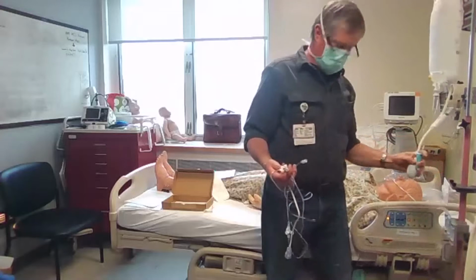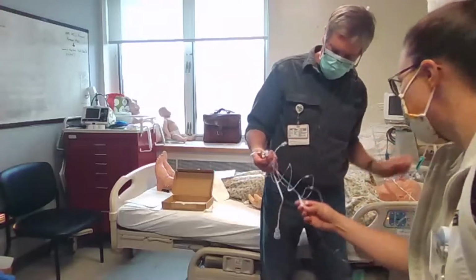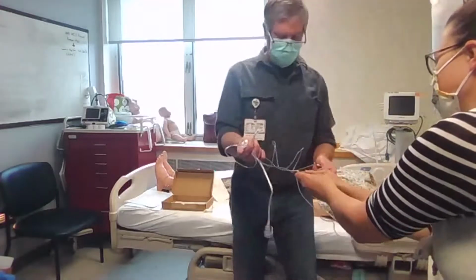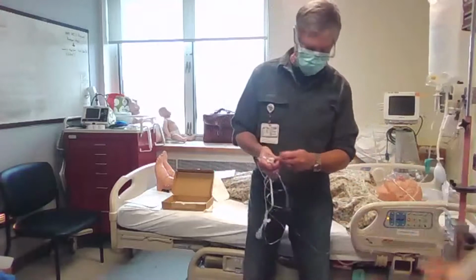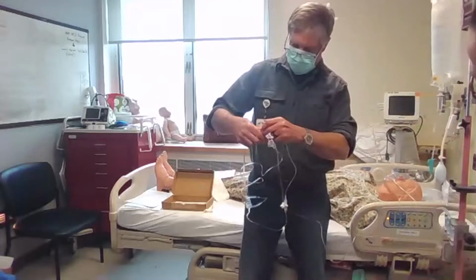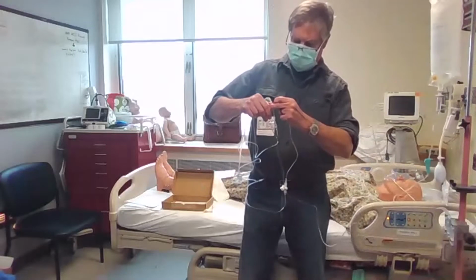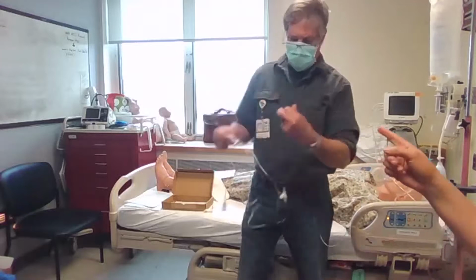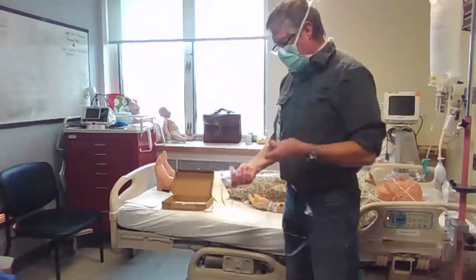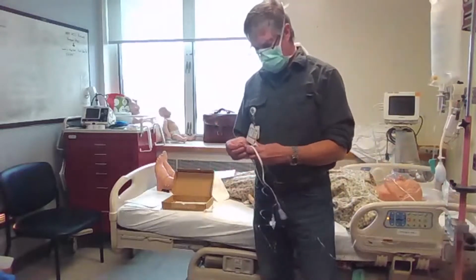It still does this to me. Being finicky. This one's also off. Thank you. Jeez, this is complicated. All right, so now it should come out. Why is it doing this? There you go. It was trapping air in it somewhere, and I don't know where. But the easy way to get by it is to pull the flush, and it'll just flush it through. But I don't know why it did that.